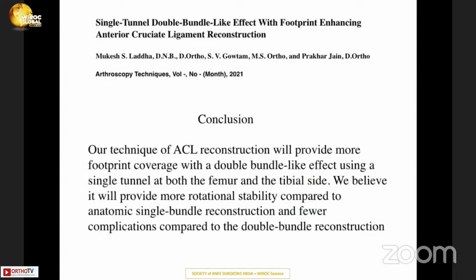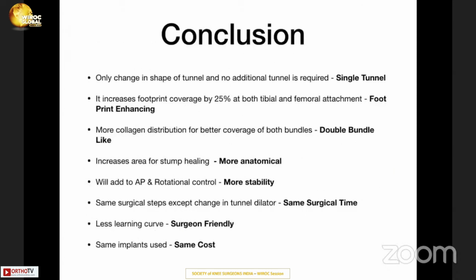The same thing, my paper has been accepted and published in Arthroscopy Techniques recently. The only difference from the other papers is that I have done the same on the tibia also, and most of the surgeons have done it only on the femur.